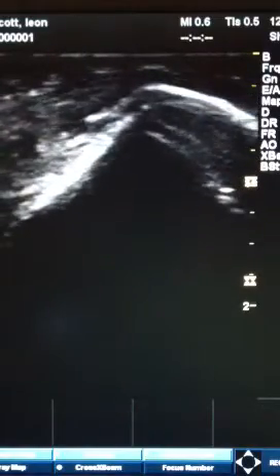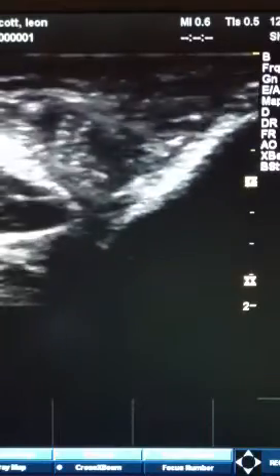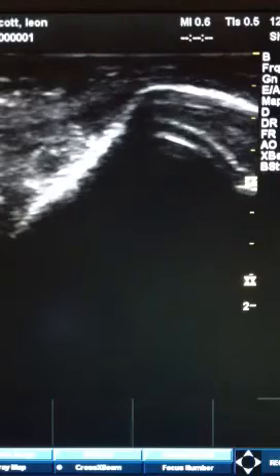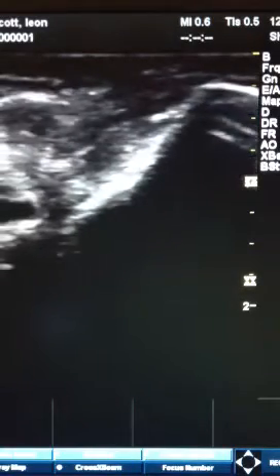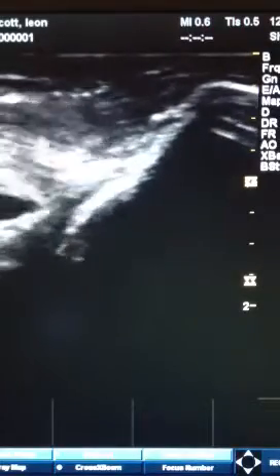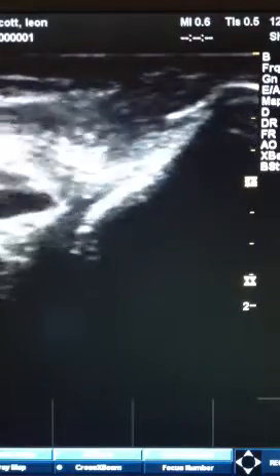On this ultrasound I'm looking at my elbow, specifically a structure called the olecranon, which looks like a mountain on your screen — the white outline. Over to the left is the tricep muscle, and I'm doing some contractions with the tricep and you can see the tendon kind of pulled taut.